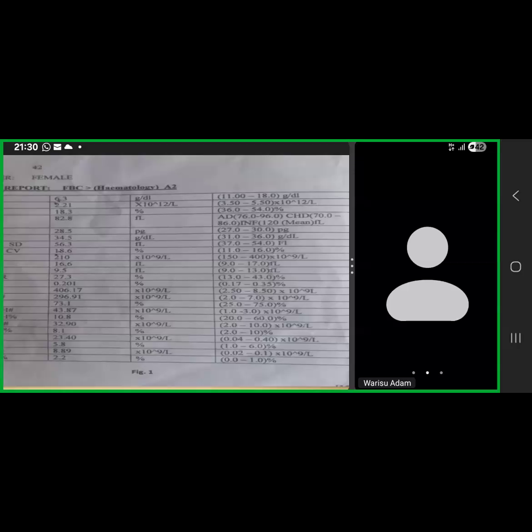And so you can think about something happening in the bone marrow where the production cells are there, but they are ineffective. They are not working. And then when you look at the different cell lines all present, it gives an idea that it's like every cell is present.